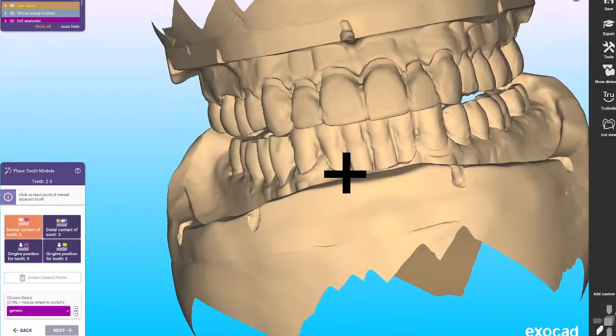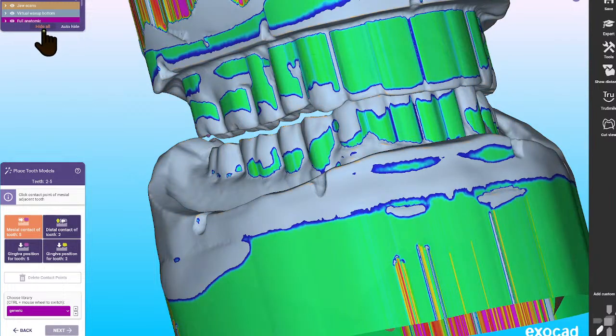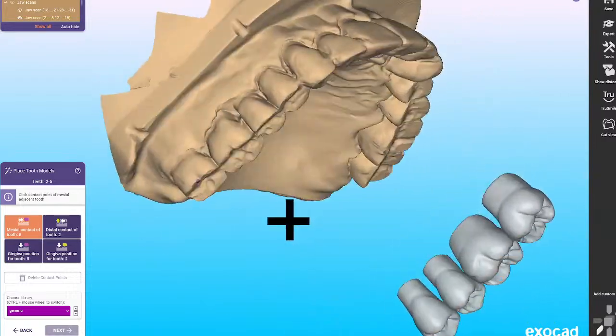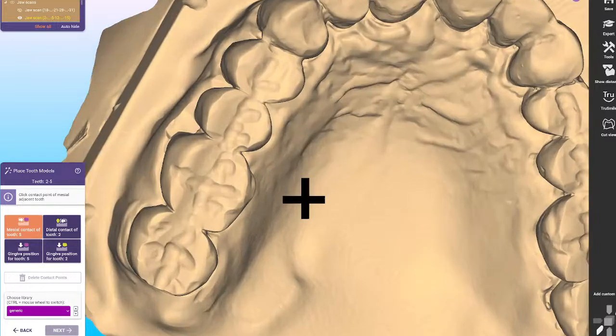Okay. So for this, I'm going to start off, it's asking right here, mesial contact of number 5. So I'm just going to hide the mandibular cast. You could do that one way, which is show all, and then you scroll down. Let's hide this one. Hide this one also. Okay, that's the top. That's the bottom. Okay. Not sure why this one is showing, yeah, 1 to 2. So 1 to 2 is over here.